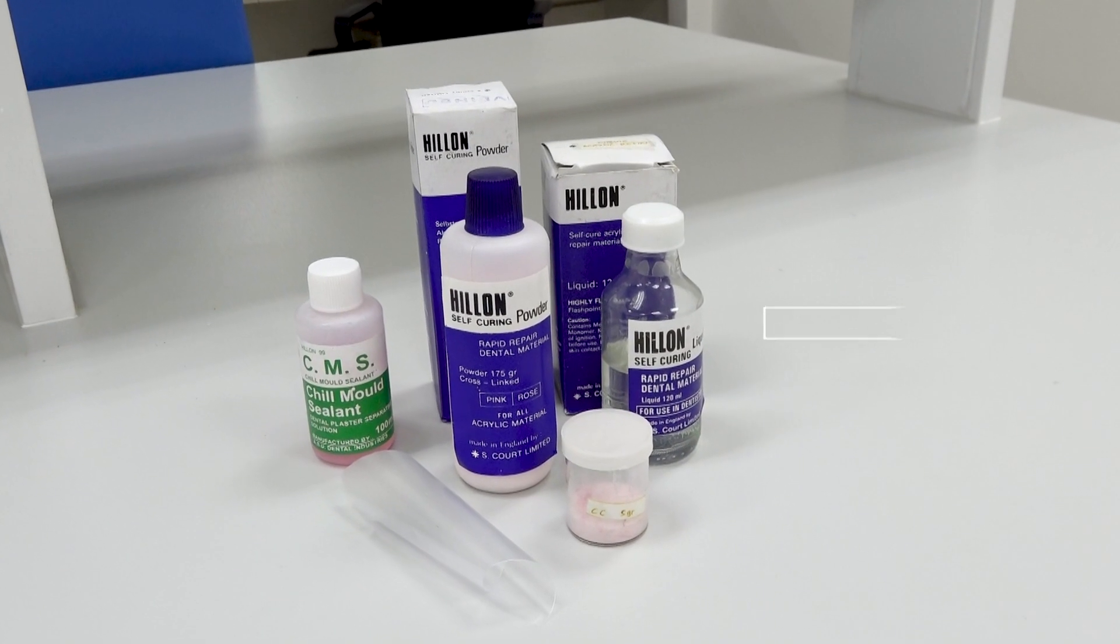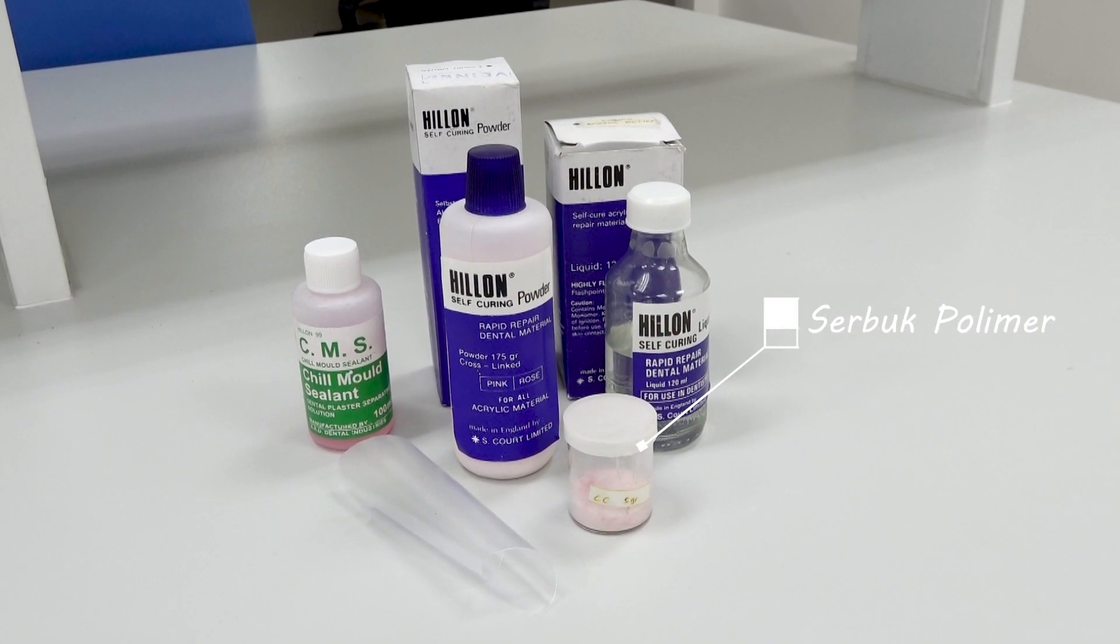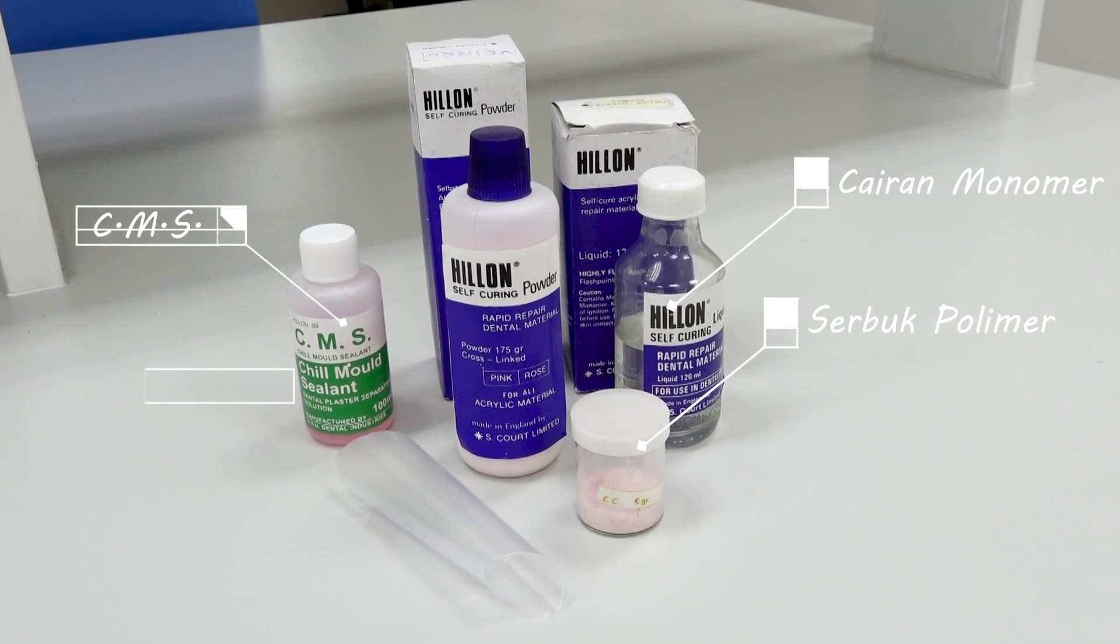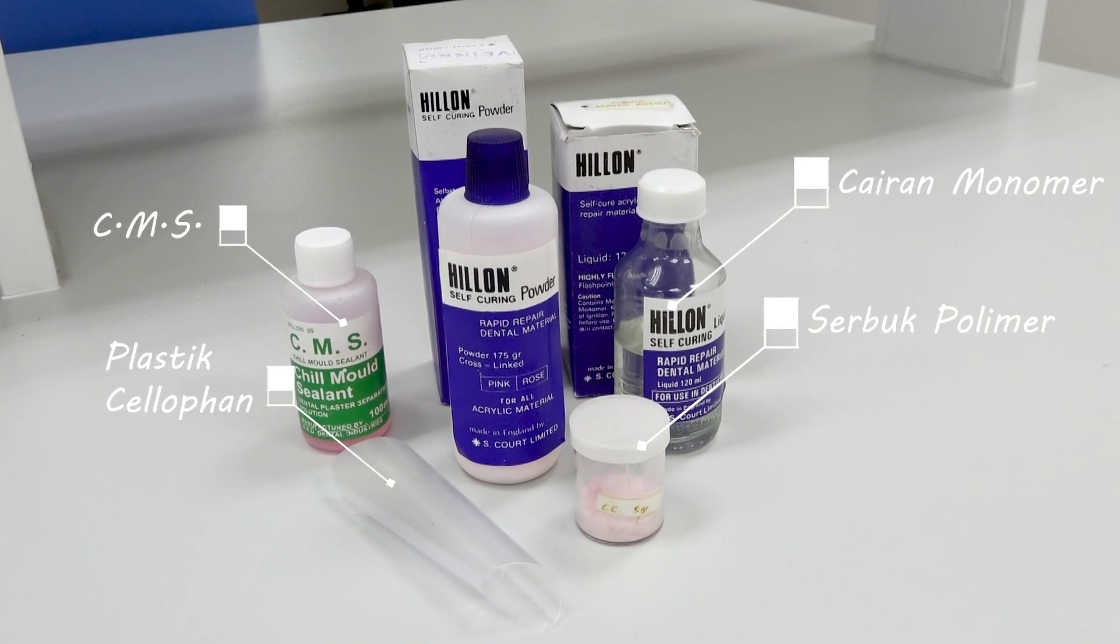Proper manipulation will produce the desired acrylic resin, which is acrylic resin without pores. In this video, we will learn the manipulation process for chemically-polymerized acrylic resin. Materials used include polymer powder, monomer liquid, CMS, and cellophane plastic.